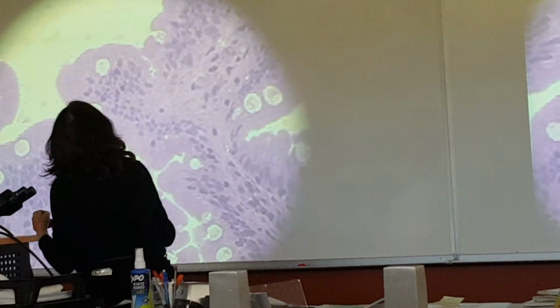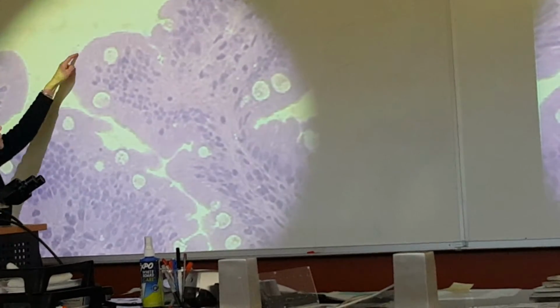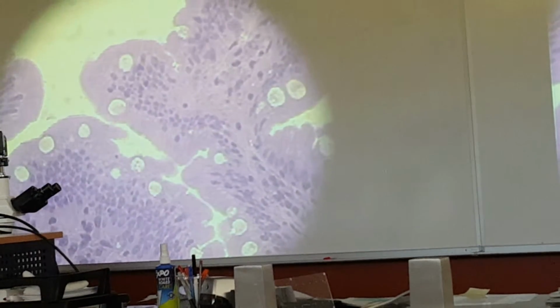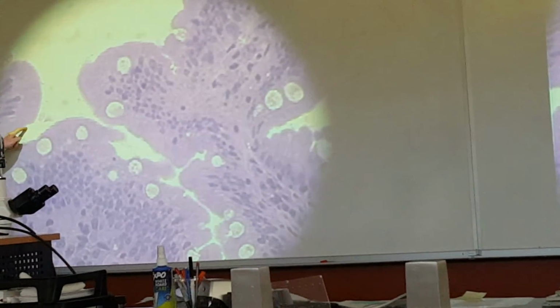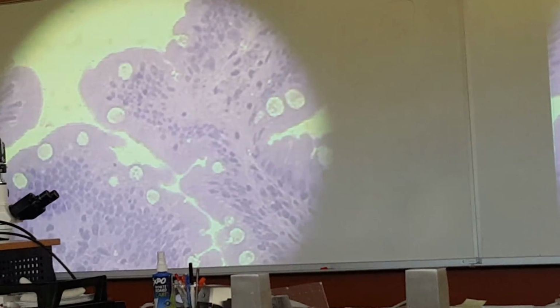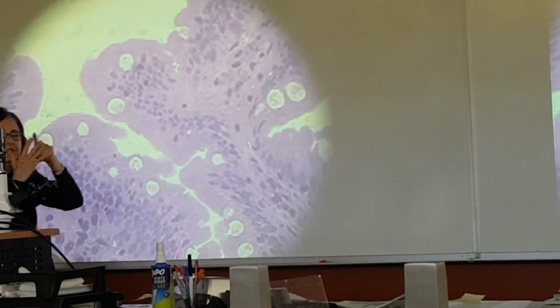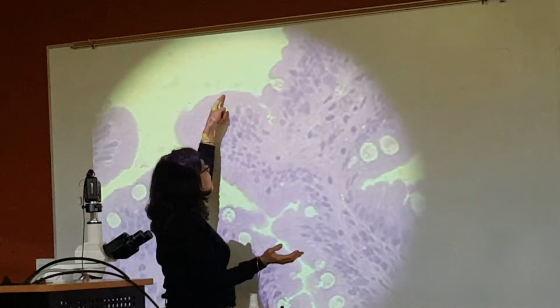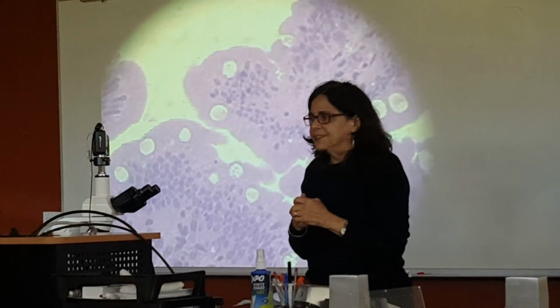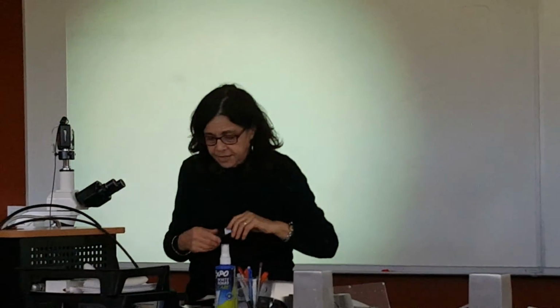Well, the microvilli are known as a brush border. It does kind of look like a brush border in here. So I'm thinking we're seeing microvilli. And yeah, for sure. So it's the outer layer. So this is the epithelial cell, and along it are these undulations, these in and out gatherings of the plasma membrane that further increase the absorptive ability, plus house what are called brush border enzymes, of which lactase is one of them. Okay? So that's the duodenum.